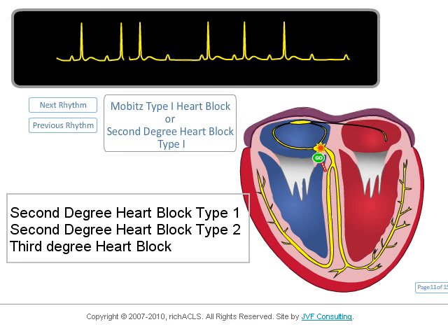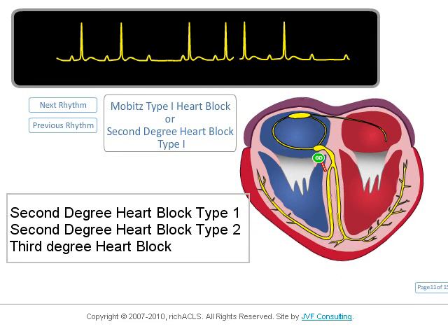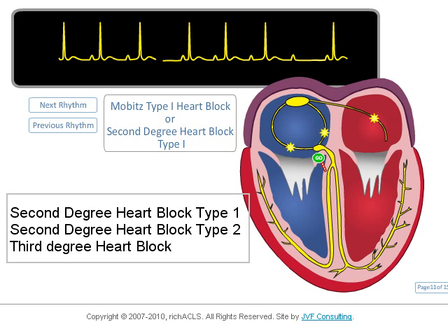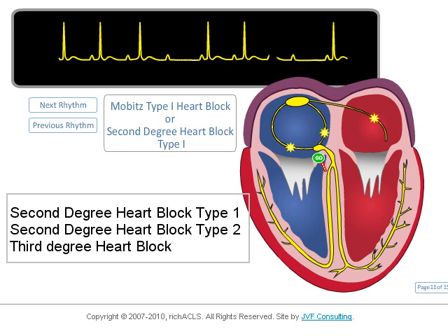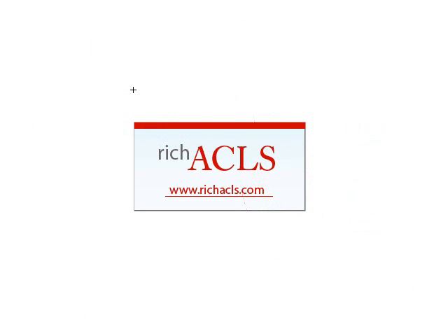In this video, we will discuss three atrioventricular blocks: second-degree heart block type I, second-degree heart block type II, and third-degree heart block. The full rhythm tutorial can be found at richacls.com.